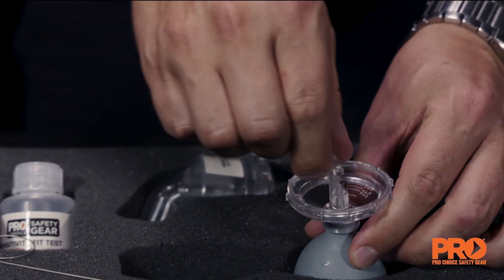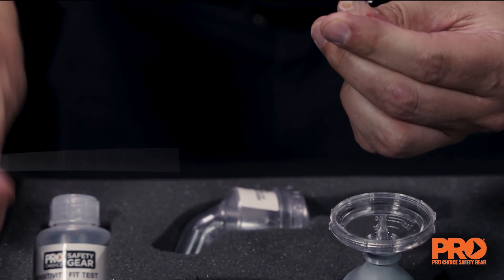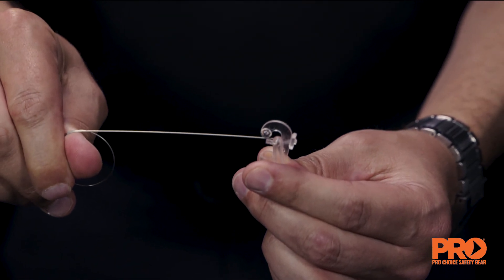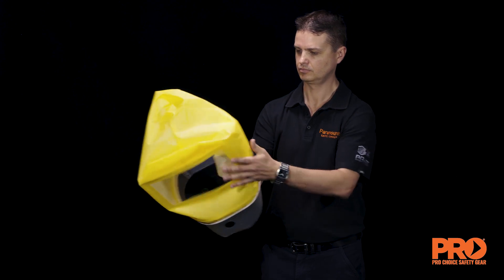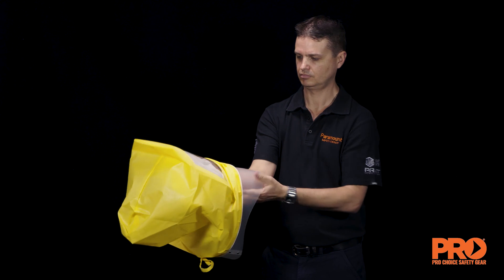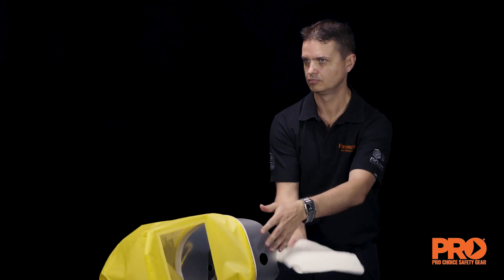Cleaning: at the end of each session, or at least every four hours, discard the unused solution from the nebulisers. Do not pour unused solution from the nebuliser back into the bottle — unused solution must be disposed of. Rinse the nebulisers with warm water to prevent clogging and shake dry. Wipe out the inside of the hood with a cloth or paper towel to remove any deposited test solution.